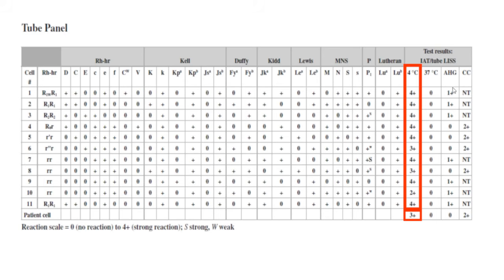We're still seeing 1+ reactions at IgG, which could be leftover reactivity from the cold. However, it is corresponding with the Kidd antibodies. So we're seeing the Kidd warm reactivity behind this cold autoantibody.